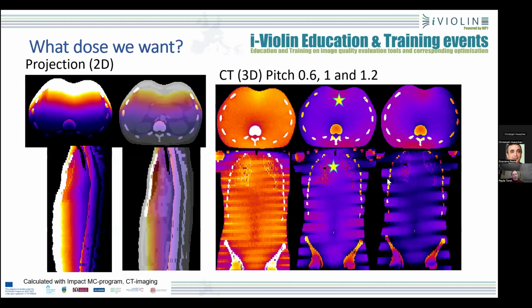So what dose do we actually want? If you look at the image, these are dose distributions. If you see bright color, it's a high dose, and blue is lower dose. On the left side, we have the projection imaging, so normal radiograph. And there we normally measure the measurable quantity, air kerma free in air, the star here.